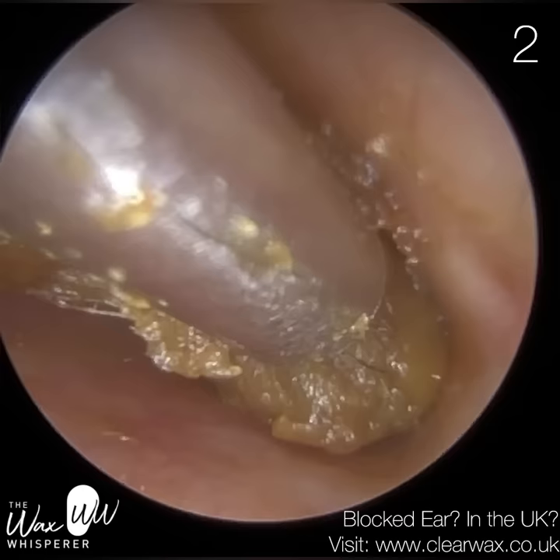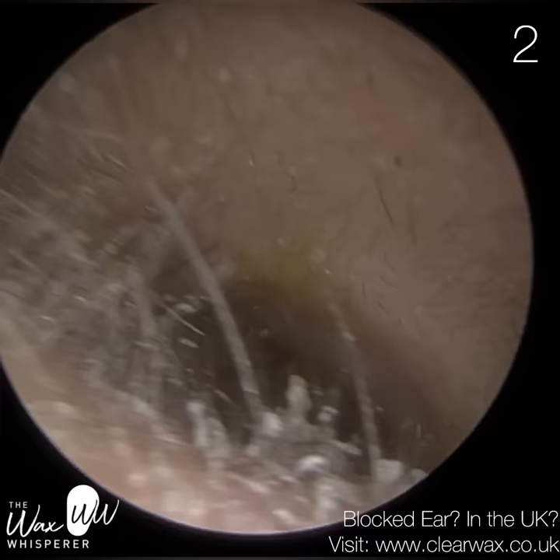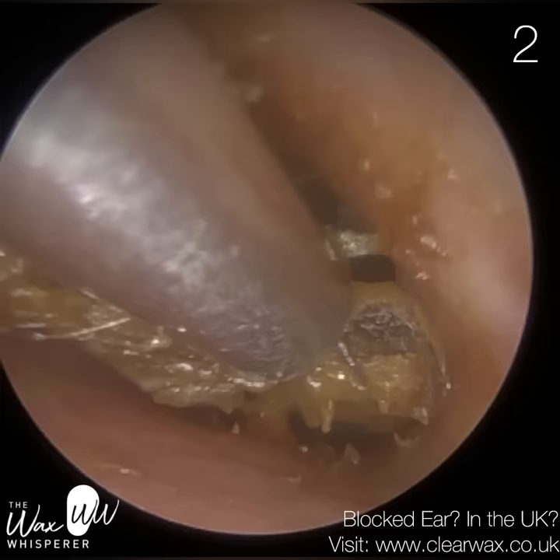That's why the bony part of the ear canal is extremely sensitive — not only because it's a very thin layer of skin with minimal buffer, but it's also up against bone, which is rigid, unlike the cartilage, which is more flexible and malleable. We've removed the majority of this wax — it's just some soft, sticky wax that I've managed to squeeze out there.